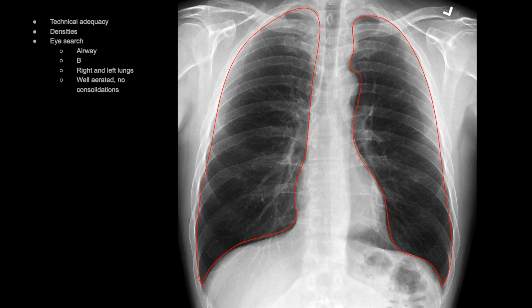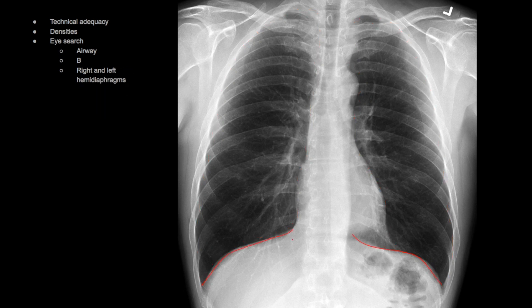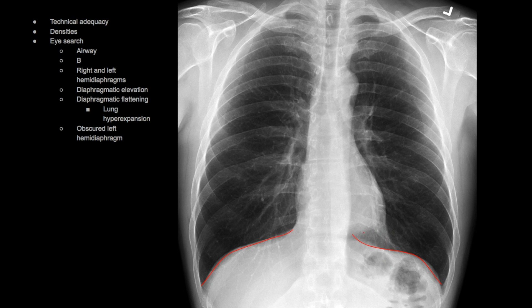B is for breathing. Pointed out here is the right and left lungs — make sure they are well aerated without any focal consolidations. Make sure to look at the lung apices bilaterally, every field of the right lung including the right upper, right middle, and right lower lung, and the left lung. Ensure that you have crisp costophrenic angles — you can see pleural effusions or blunting of the costophrenic angle here. Next, look at the right and left hemidiaphragms. You have to be able to see the entire left hemidiaphragm, even below the heart. If it is obscured, that means there is a focal consolidation in the retrocardiac space within the left lower lung. Check for any unilateral diaphragmatic elevation, and note that diaphragmatic flattening is associated with emphysematous disease and hyperexpansion of the lungs.